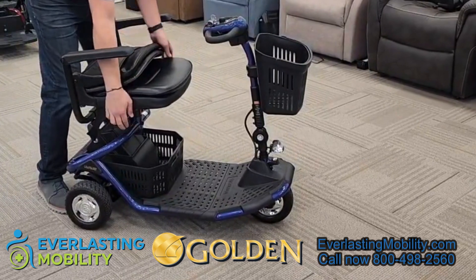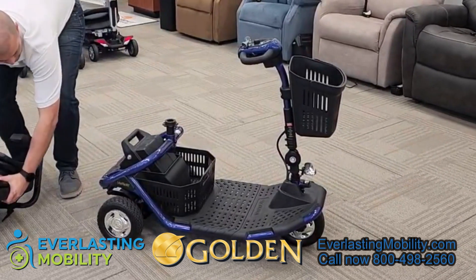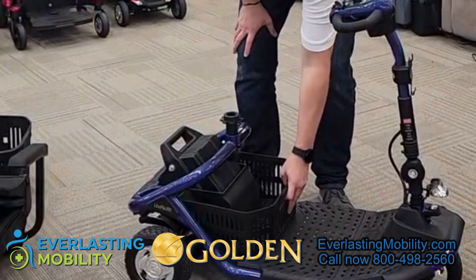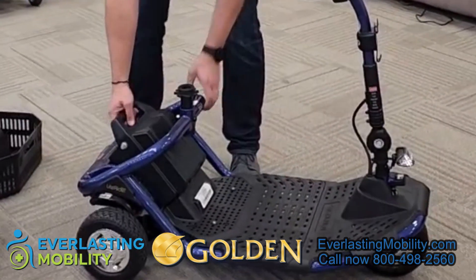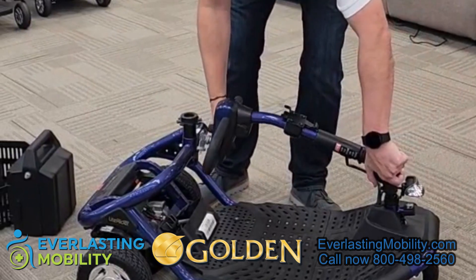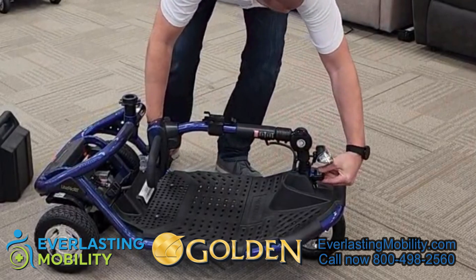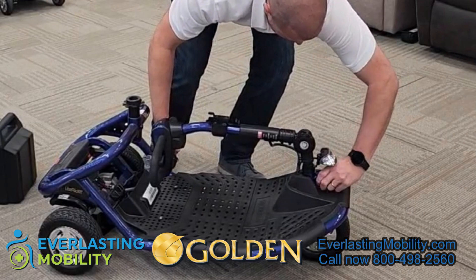To disassemble the scooter, put the seat back down, use the lever on the side, and lift the seat straight up. Next, pop off the basket by applying pressure to the bottom. Then remove the bottom basket, which is secured by magnets. After that, remove the battery pack, then fold the tiller down. Use the locking mechanism on the front of the scooter underneath the headlight — once you press that in, the tiller will not move and is secured in place.